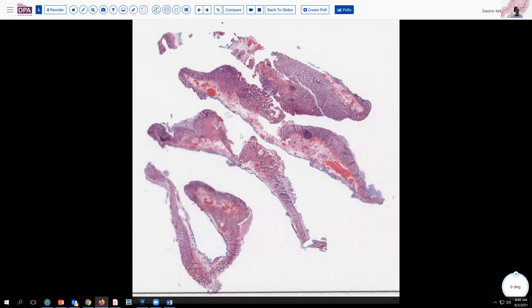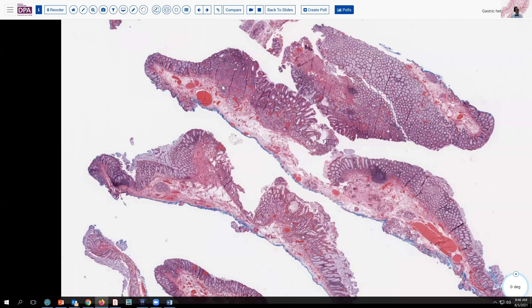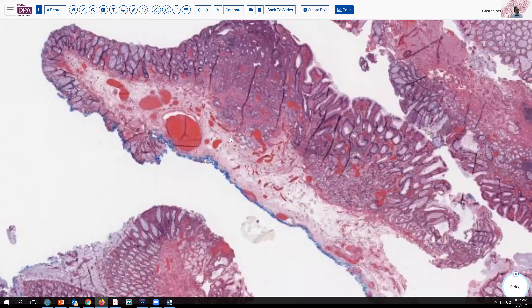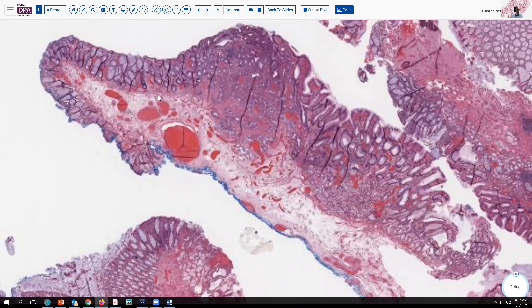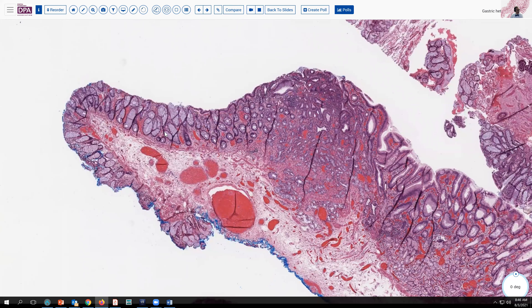As you can see, we've got several centimeters of colorectal mucosa. Here we can see maybe this rolled raised edge and a central depressed area in some of the sections. As we hone in on this area, we can see that on the edges here we have normal colonic mucosa with some degree of vascular congestion, and then we have a little bit of a gland-forming lesion extending into the submucosa slightly.